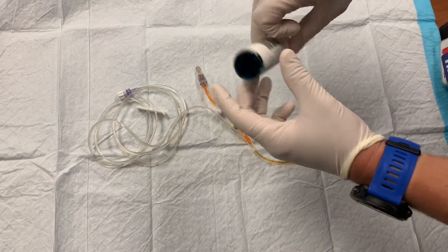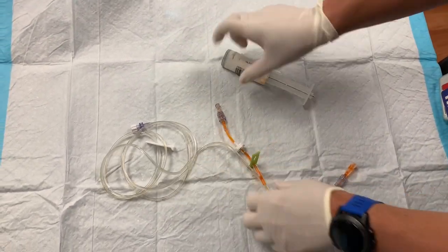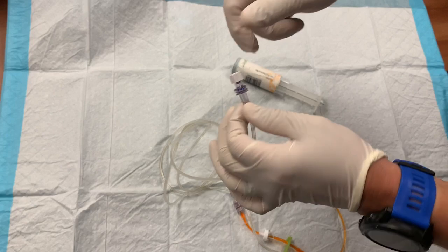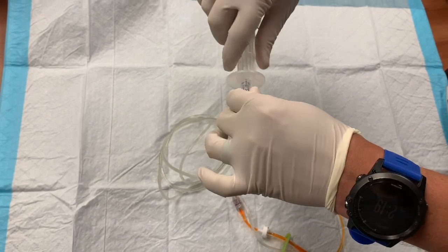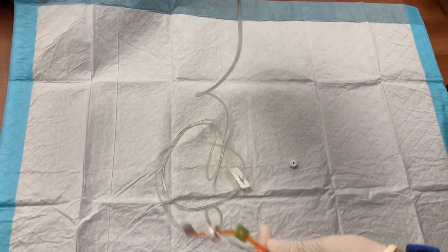Now take your medication syringe and attach it to your IV line. Go to the other end and find the adapter piece, then screw that onto the base of the plunger you just attached to your medication. Once that's nice and tight, take it over to your PCA pump and we'll get started.